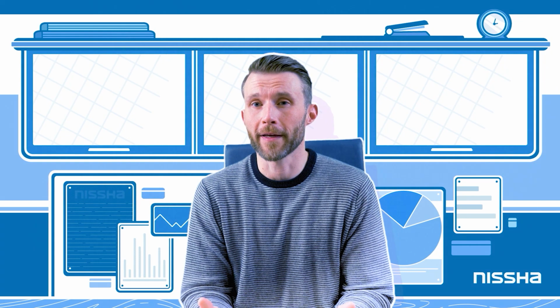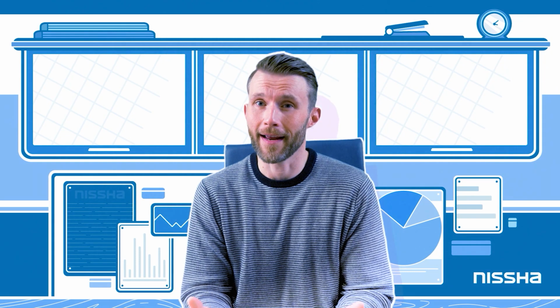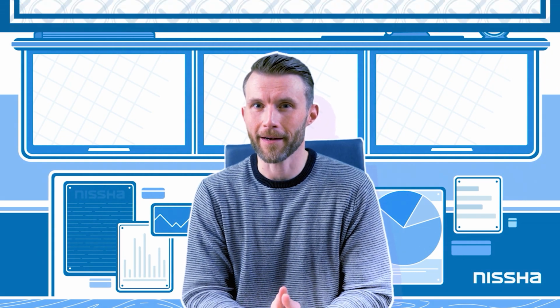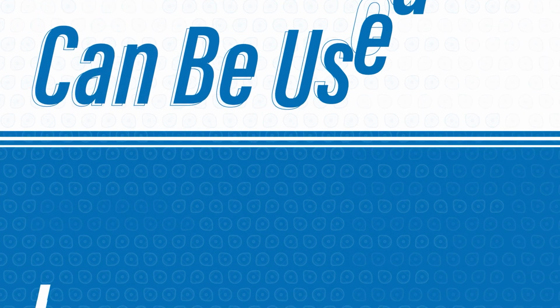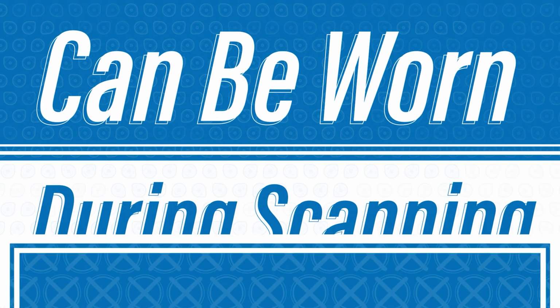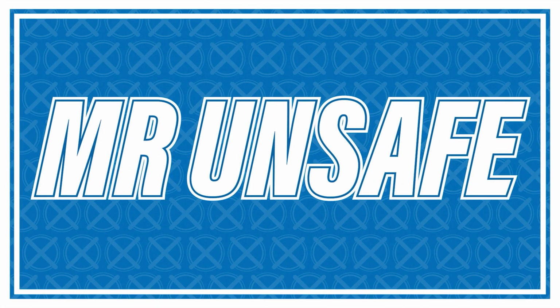What are the differences between MR Safe, MR Conditional, and MR Unsafe? Let's find out. MR Safe is the easiest one to understand. It means that the product can be used in the MRI room and it can be worn by the patient during scanning.